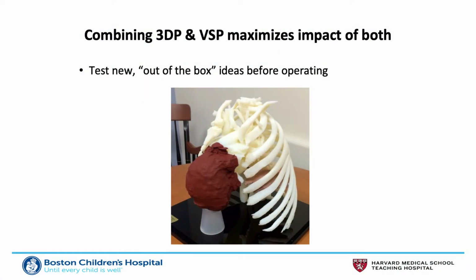But one of the problems with VSP is that in cases like this that are unusual, not following some pre-planned methodology, you can do almost anything, even if it's not something that is physically possible to do on a real patient. Knowing this, we didn't jump into operating on her. We took that digital model and then made a life-size 3-dimensional model using 3D printing.